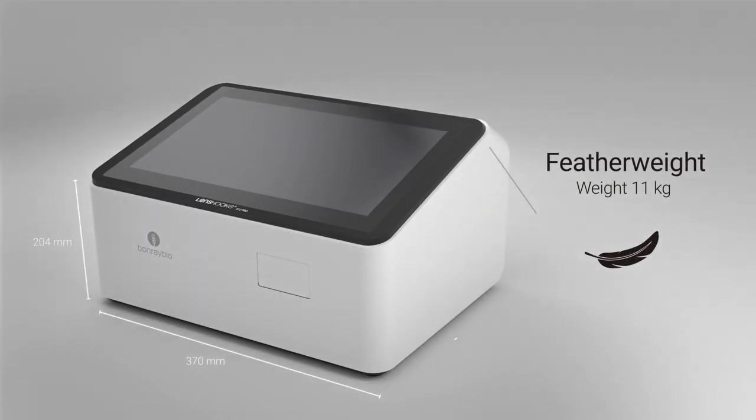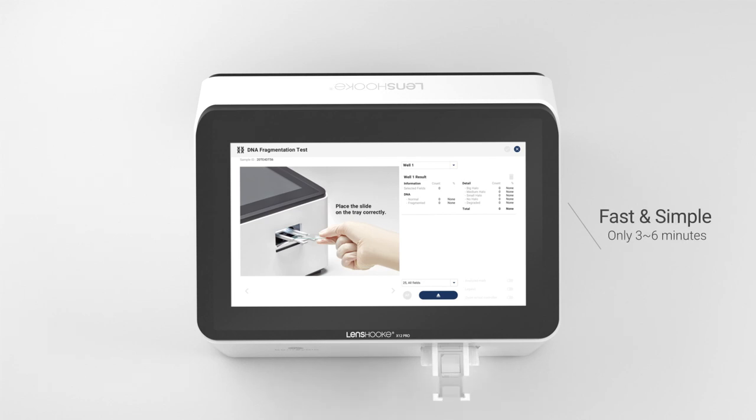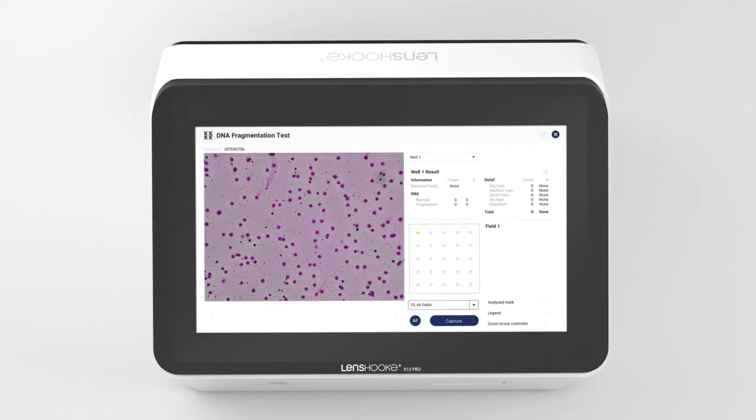This machine is compact, light and only takes you three to six minutes to complete one sample examination.